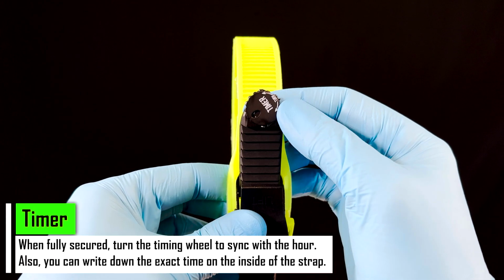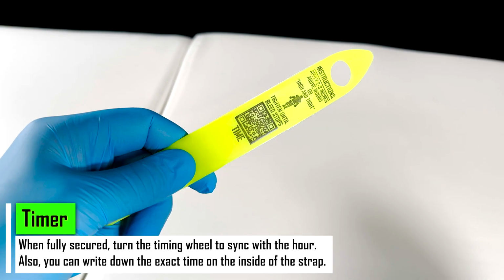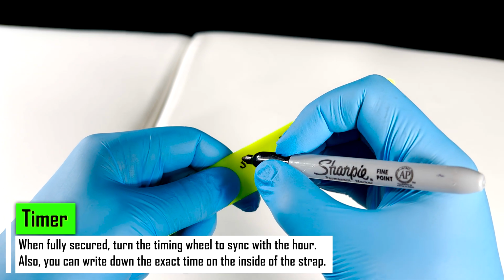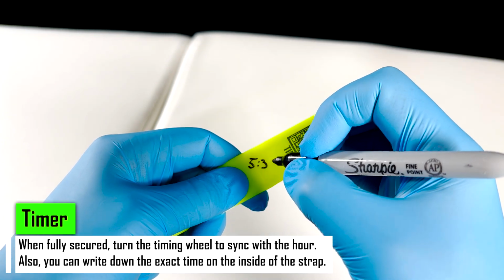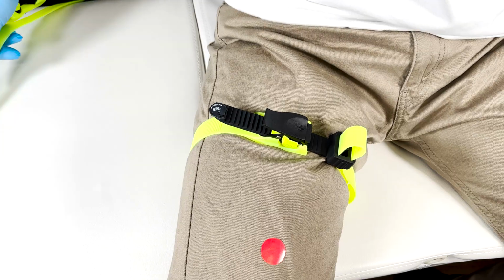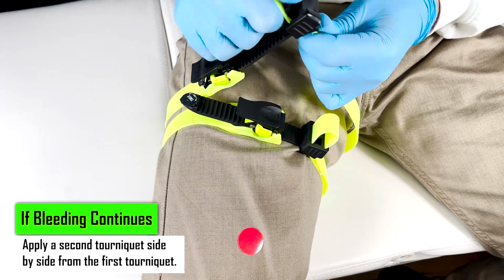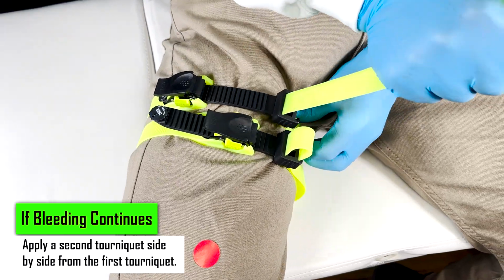Timer. When fully secured, turn the timing wheel to sync with the hour. Also, you can write down the exact time on the inside of the strap. If bleeding continues, apply a second tourniquet side by side from the first tourniquet.